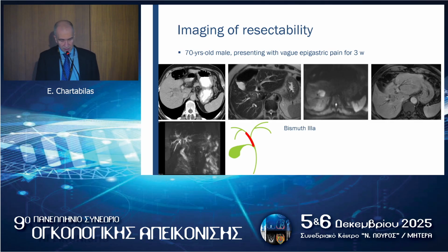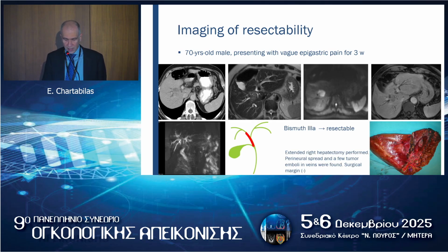It was considered resectable, so operation was performed. And indeed, the surgeon achieved an R0 margin. However, perineural spread and tumor emboli in veins were found.